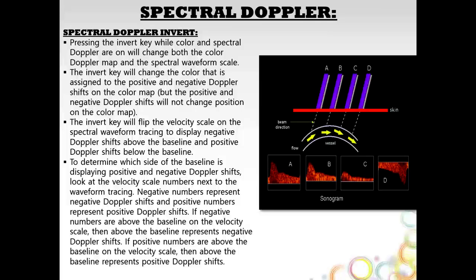So how we tell what we're looking at on that is you want to look at the baseline and figure out if there's positive or negative Doppler shifts above or below that baseline, and that will let you know if your invert key is on or not.